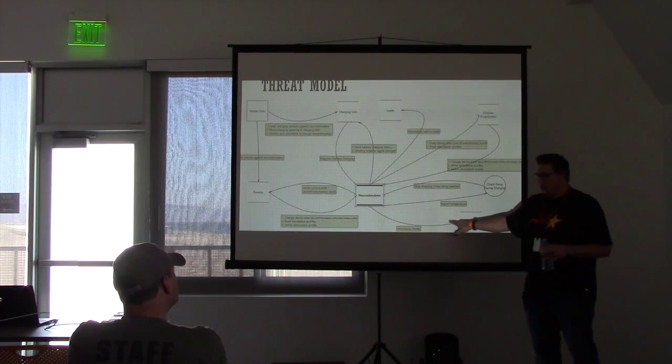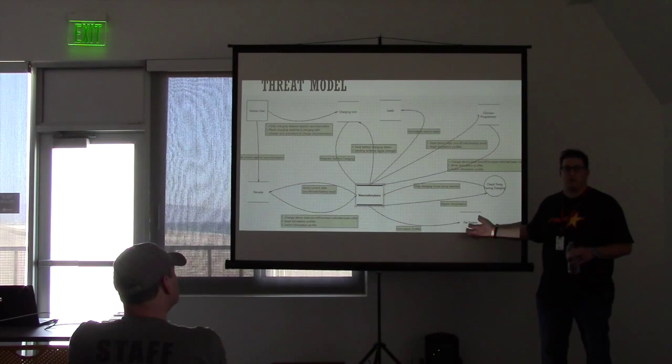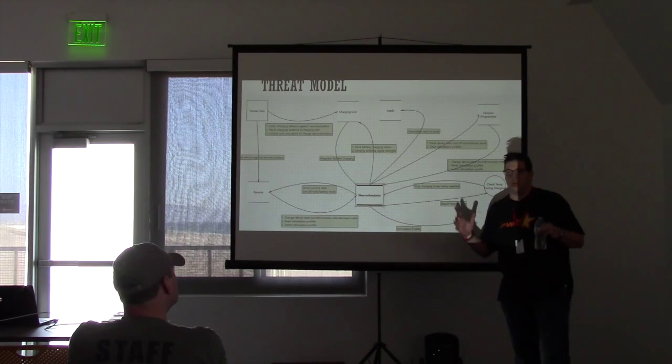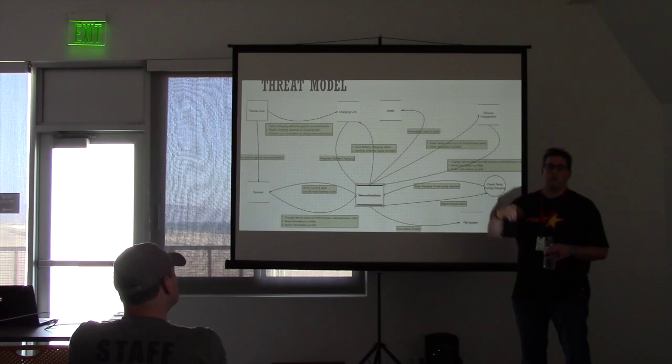So then we've got the file system where the device is, where the information is being written to, and this is just the pain management profile itself. The leads that are used, they kind of look like something out of Aliens. It's a long stem with leads on it that connects to different parts of her spine.